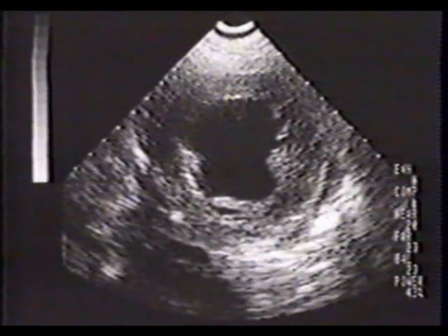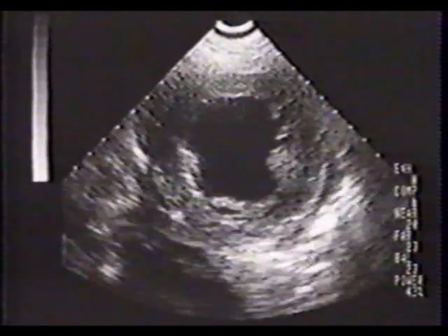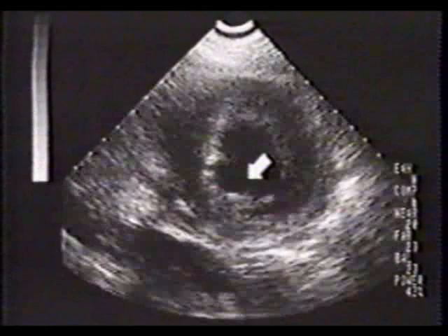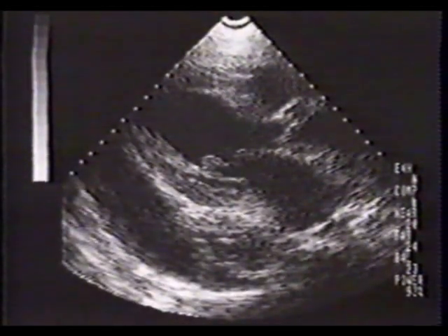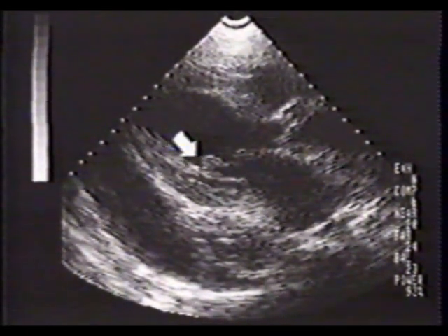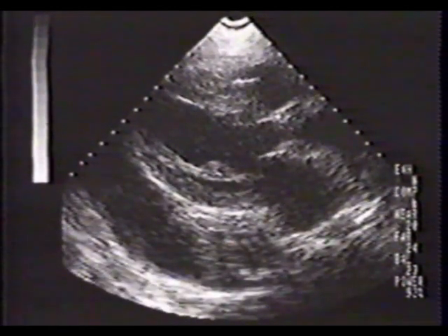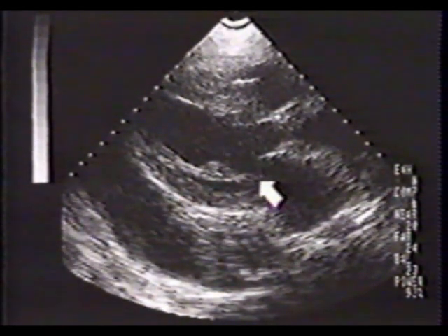We will now scan upward to the heads of the papillary muscles. Notice the wobbling of the posteromedial papillary muscle. This is a peristernal long-axis view. This is the base of the papillary muscle, and this is the partial rupture. In systole, you can see that the distal portion of the anterior mitral leaflet is not properly supported.